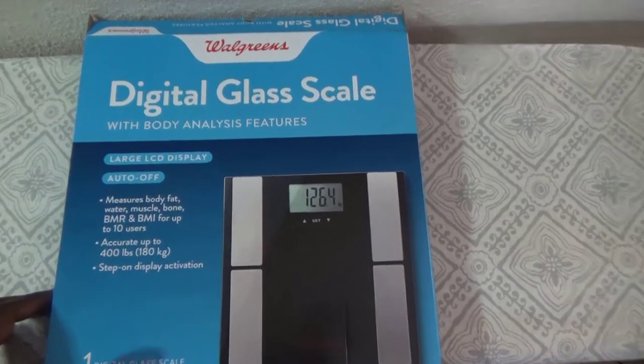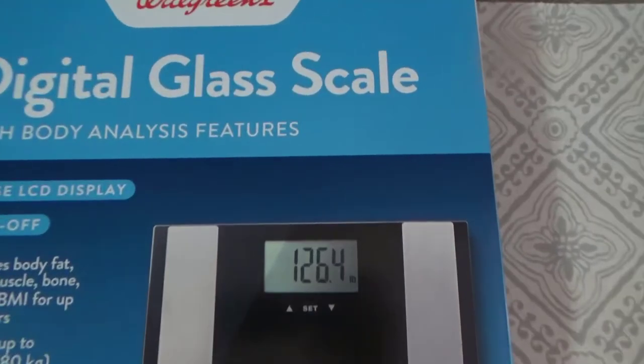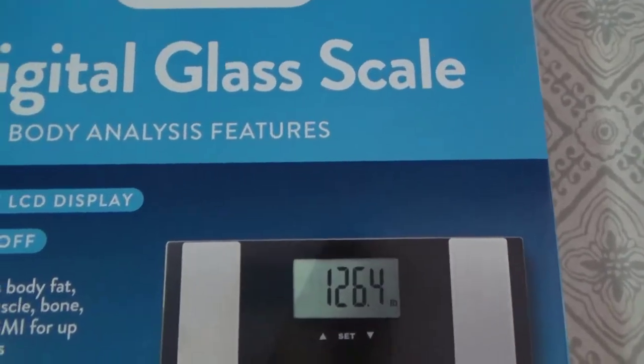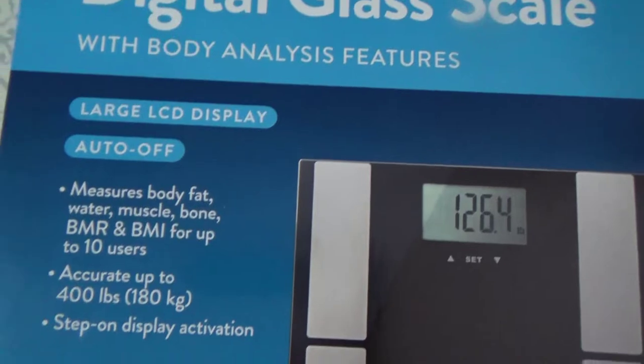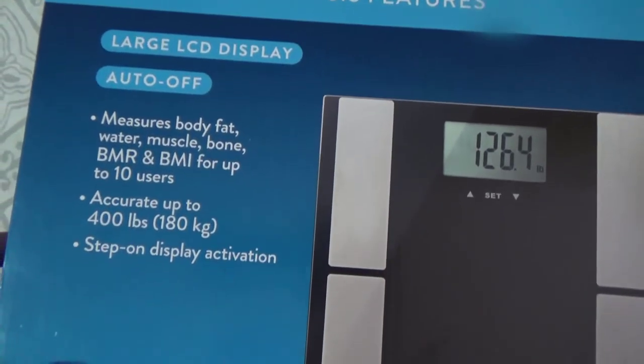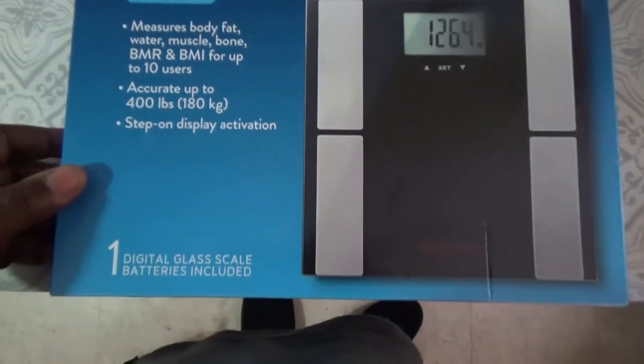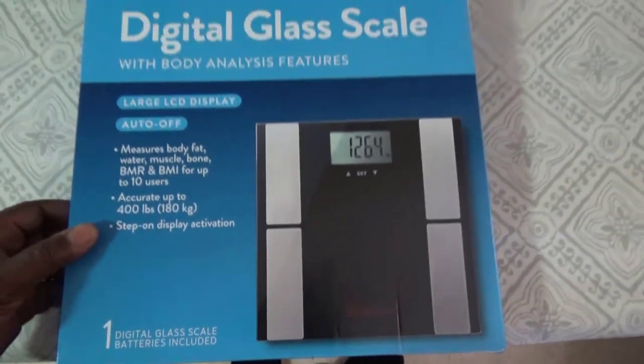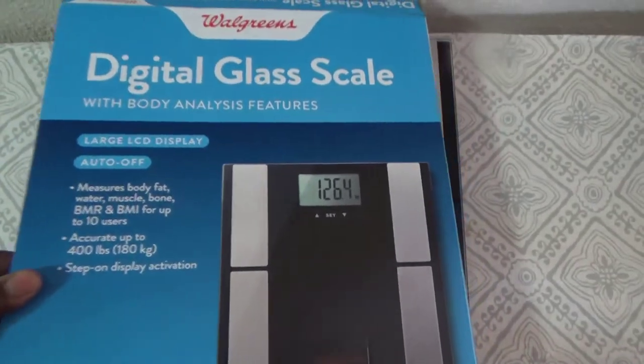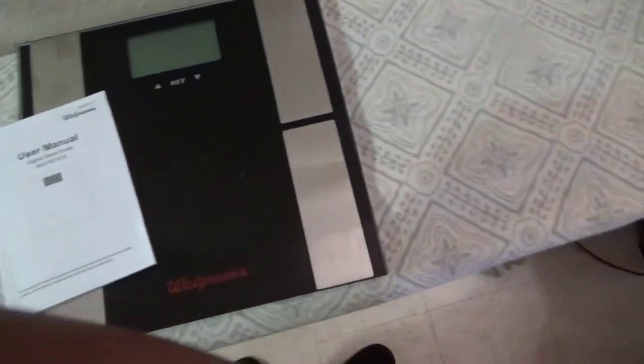I'm gonna do a quick video on this digital glass scale that I picked up at Walgreens. It's really simple to operate, so I'm gonna give you an overview and how to use it.